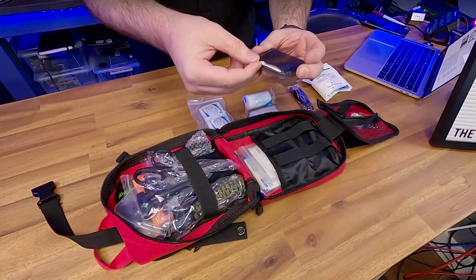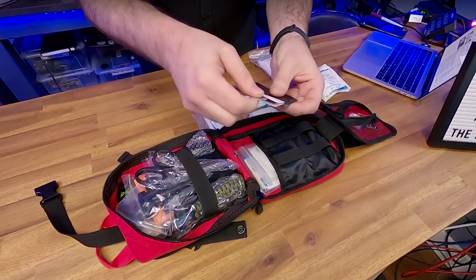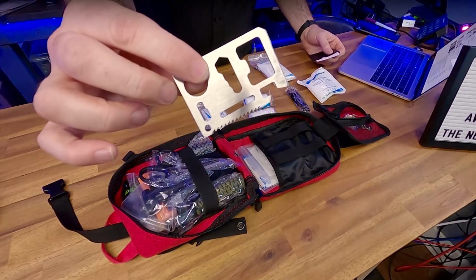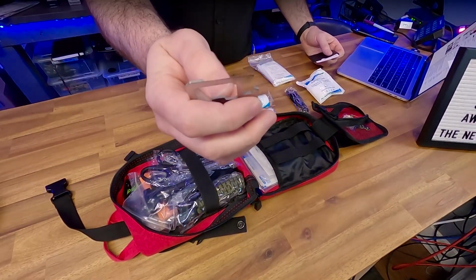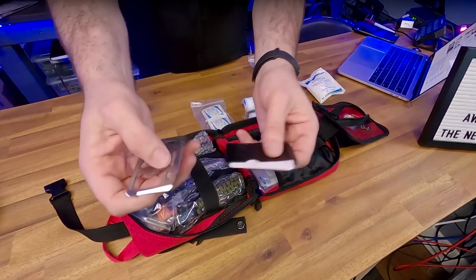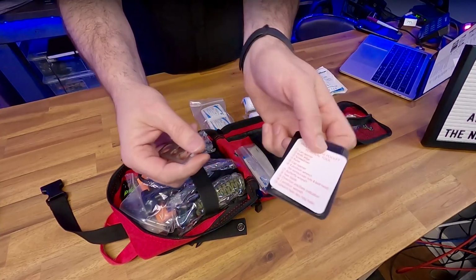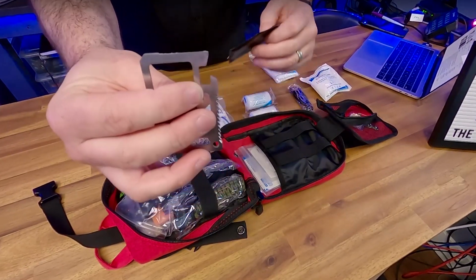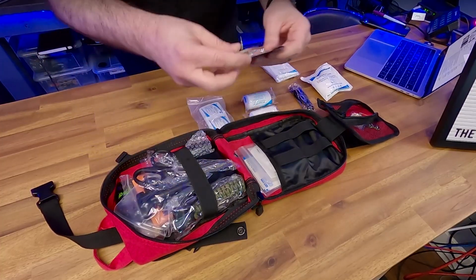You've got a multi-card here. Inside of this is something that can actually tighten wrenches. So it's got some hex tightening, bottle opener, saw blade, knife, it's got a sharpened edge, and it's all listed in this, right here. It's also got a can opener. It's got like the old military style can openers there. So you can hook that in and open a can.